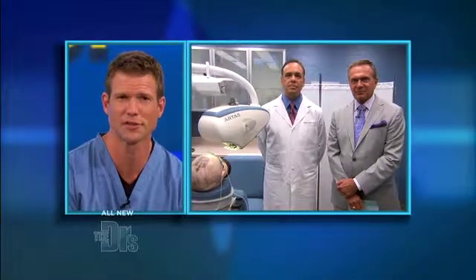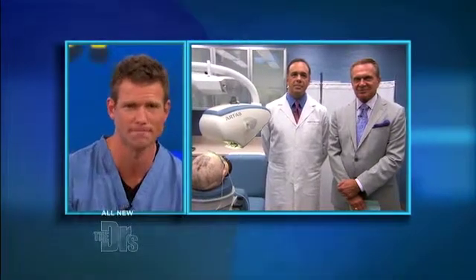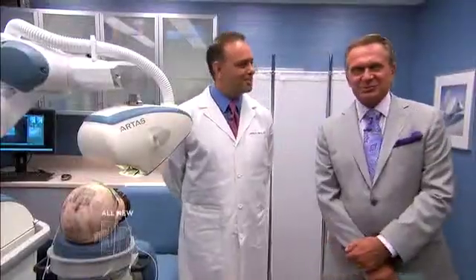Here to help us explain this procedure is Dr. James Harris, a hair restoration surgeon, in our procedure room with Dr. Ordon. Thanks for being here. Thank you for having me. So talk to us about the ARTAS machine.